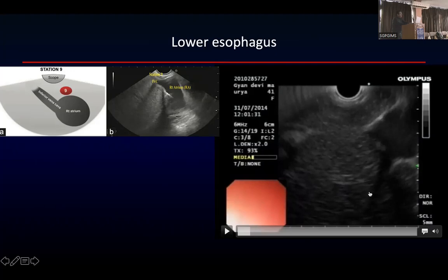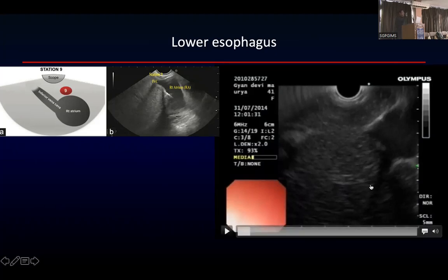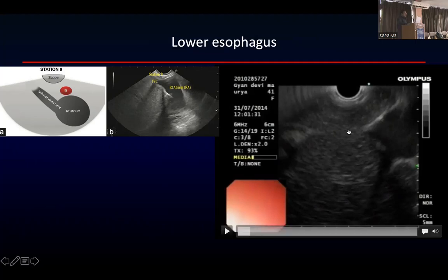Which hepatic vein? Right hepatic vein. So why right hepatic vein? Okay, so I just tell. See again, imaging of liver segments. I think I have not included it here, but it's good to know it. Sometimes it's difficult, but it's good to understand. If you have a good knowledge of your anatomy, you will be able to understand it very easily. Whenever you are seeing the intrahepatic portion of the IVC, the vein that you will see is an RHV. Okay, that is an RHV.